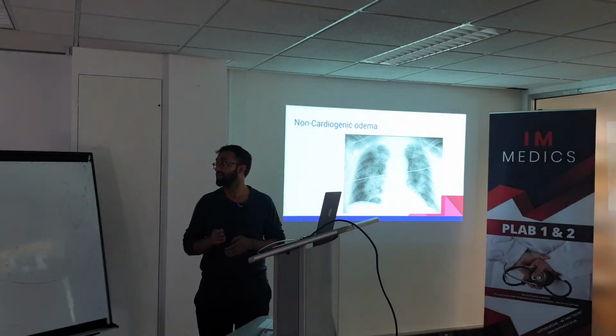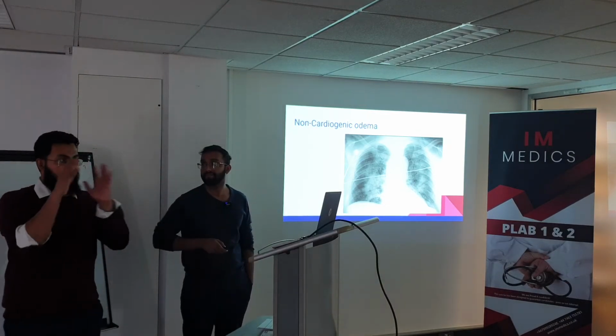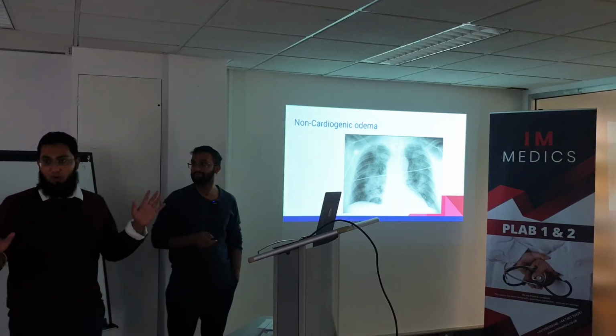So we'll just quickly go over it once more. Okay, there's a few basic things, just more focusing for PLAB. So that's just sort of a general overview.